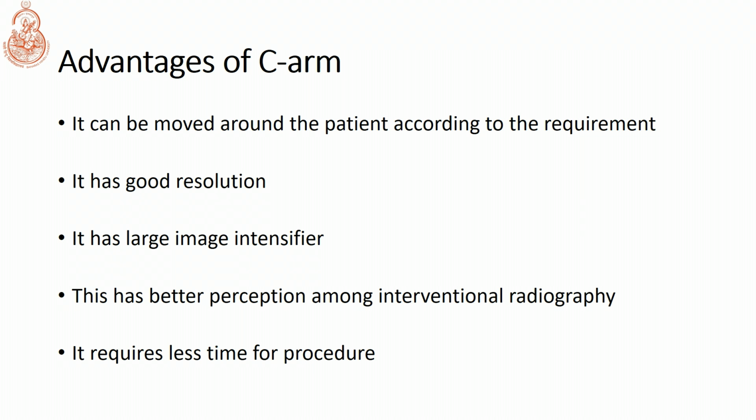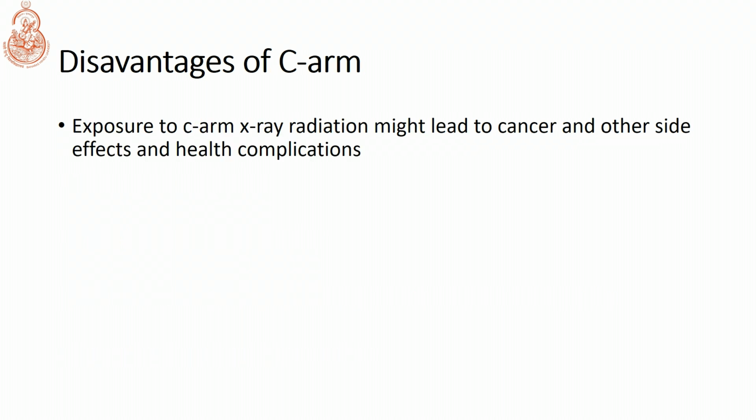This has a better perception among the interventional radiography, and it requires less time for the procedure.